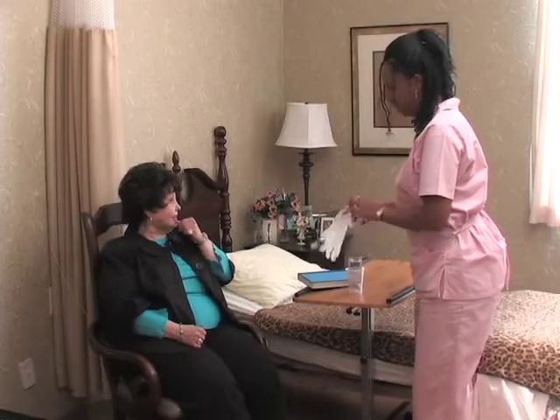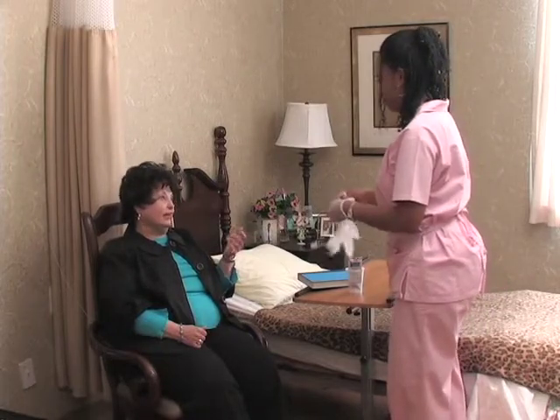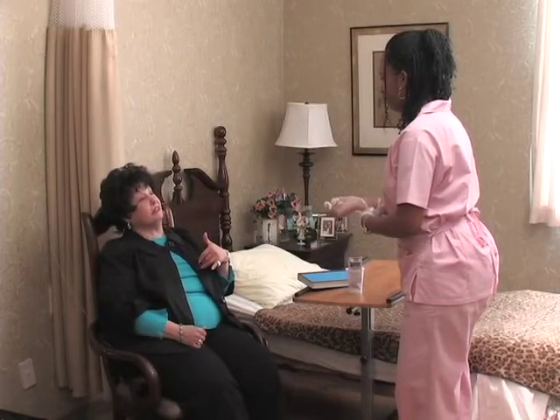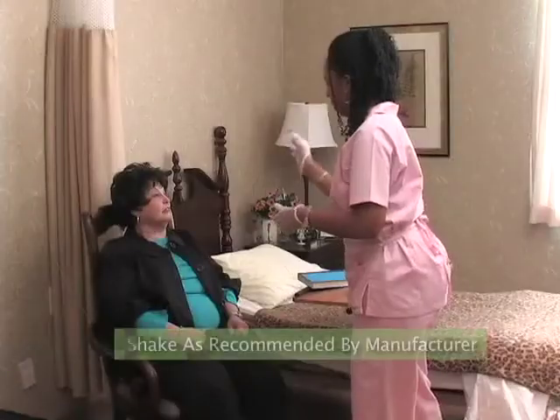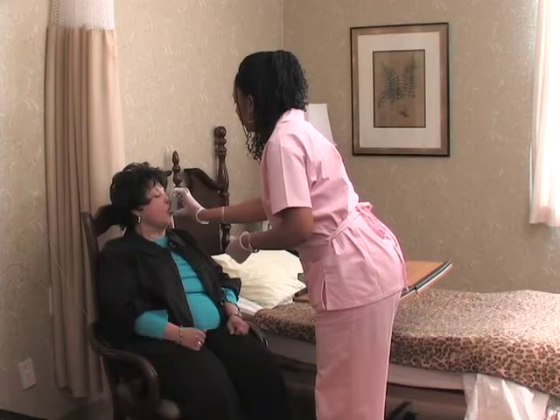Do you remember how to use the inhaler? Yes, I'm supposed to breathe out, and when you count to 3, I believe, then I'm supposed to take a deep breath in. Correct. Okay. I'm going to count to 3. Open up. 1, 2, 3.